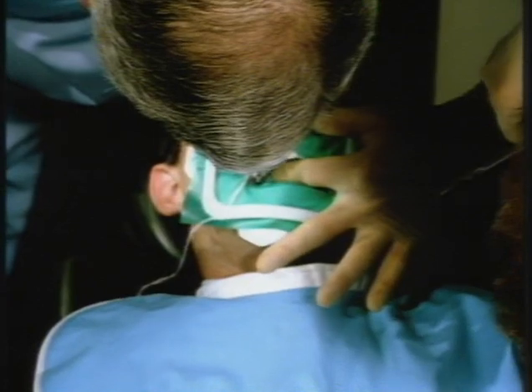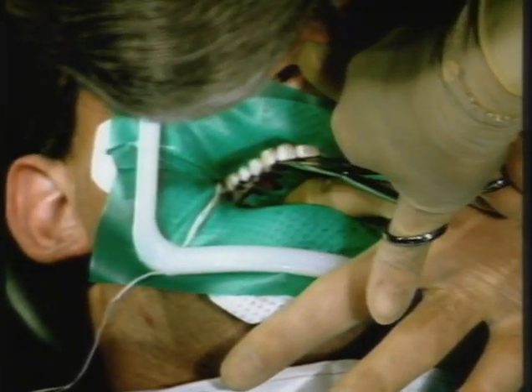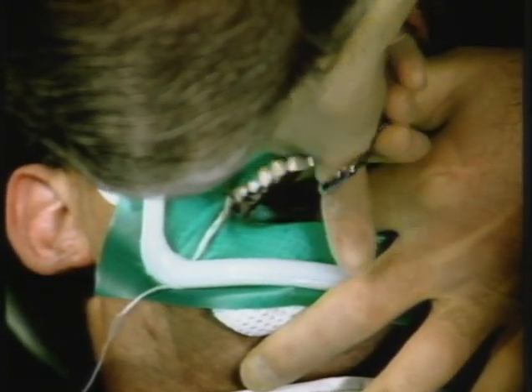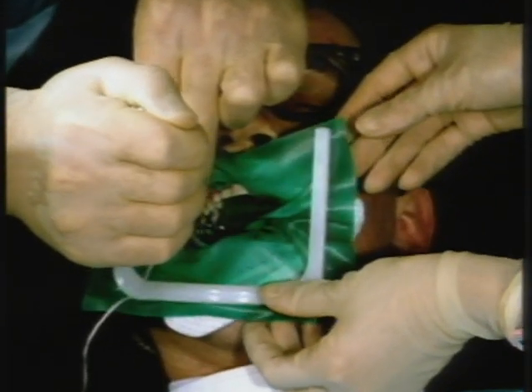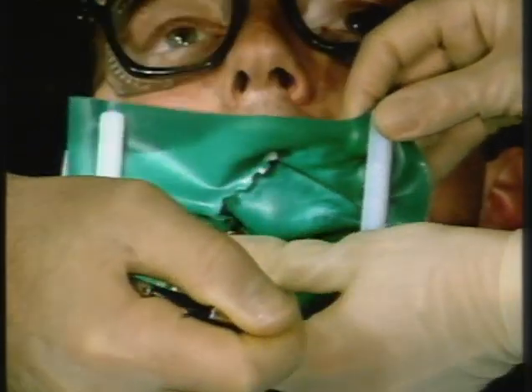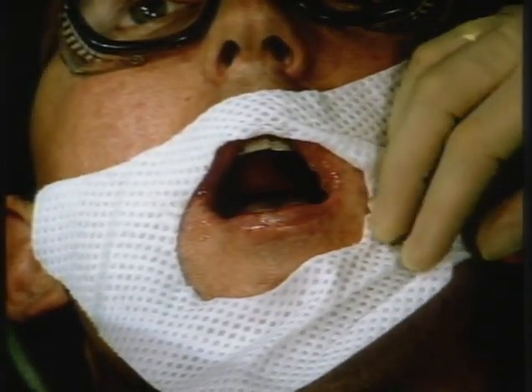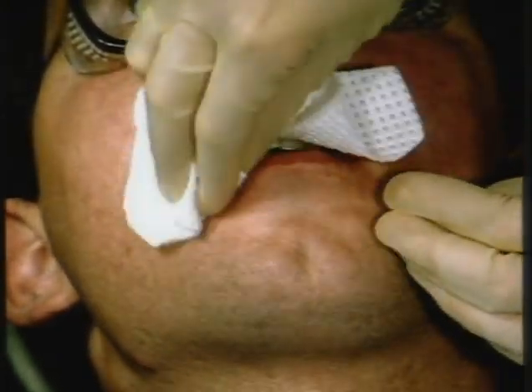Now, removal of the rubber dam. The important thing here is to have a quick and efficient method. Stretching on the palatal side is relatively simple for upper dam removals. And she's managed to cut all the interseptal rubbers. And that all comes off together in one movement. And then the napkin is very useful for just wiping the patient's face at this stage.